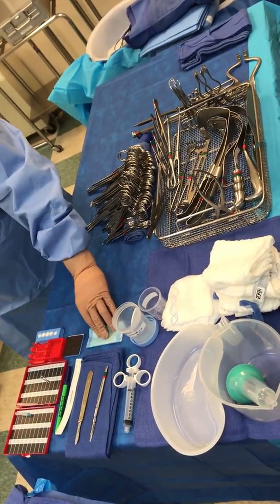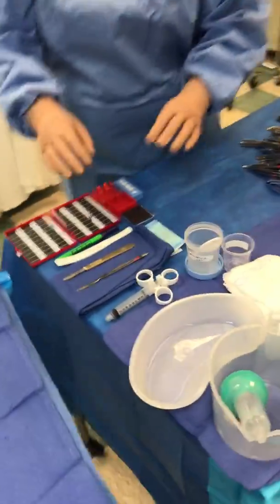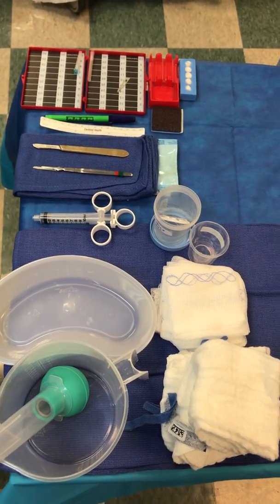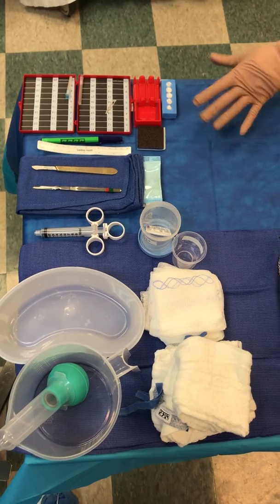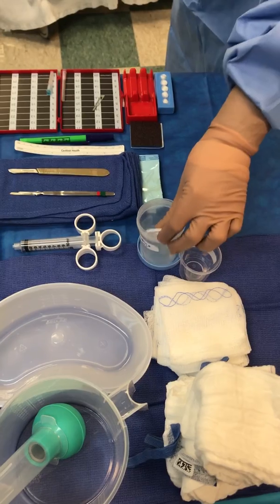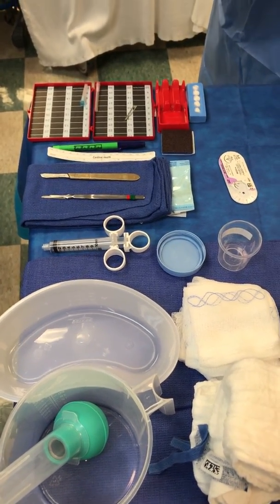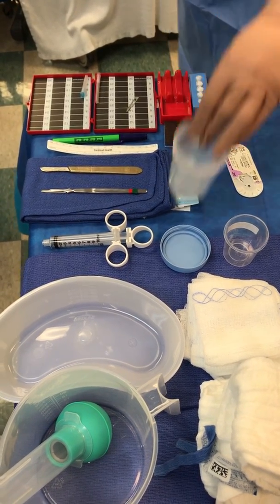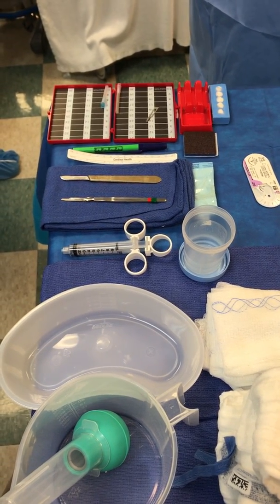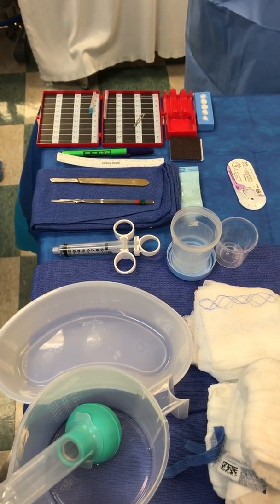And this is how I want you guys to set up. Steri strips, if you're gonna open them, they cannot be out. You know why? Because that's to put dressings on the patient after the case. If you have them out there, what's gonna happen? They're gonna get dirty. Dirty or wet. You're gonna have blood on the field, you're gonna have whatever. This is a specimen cup, and this is a medicine cup. They have it backwards. They have appendix on this, and they have one or the other.